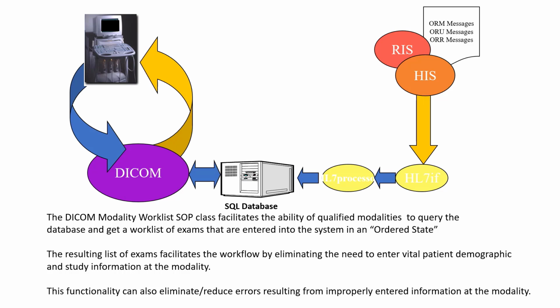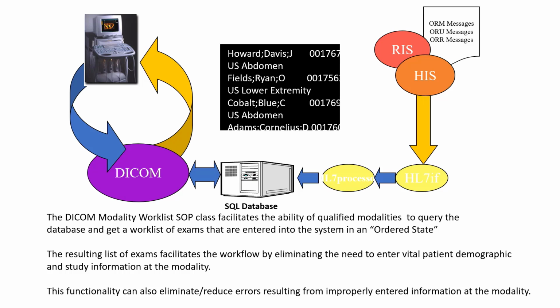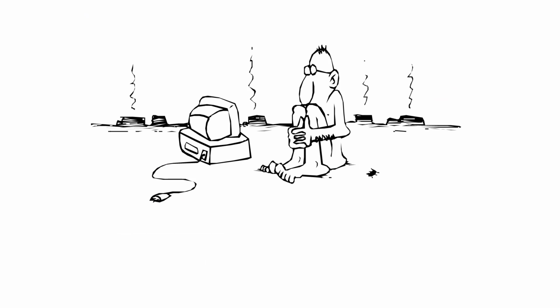When the radiologist completes the reading, the data is sent to the hospital information system and it is deleted off the radiologist's work list. To be able to accomplish this, the data, which is comprised of both images and text, has to be in the DICOM format.